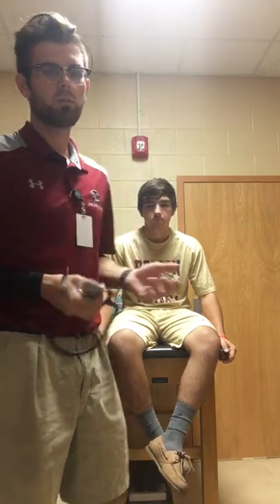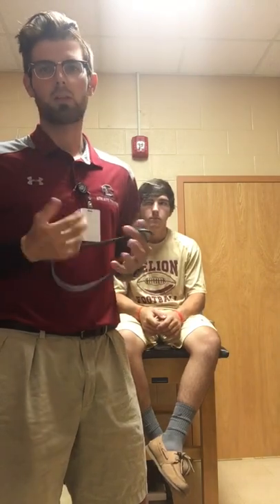So the first thing you'll need is your stethoscope — just a normal stethoscope is fine. Typically you would like to have the patient with their shirt off, but in this case, for privacy reasons, I'm going to keep his shirt on.